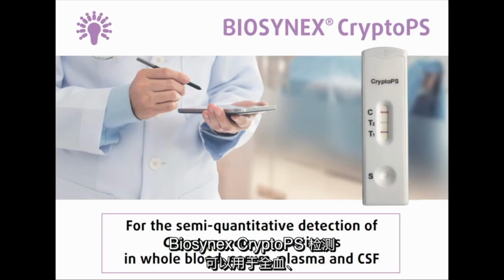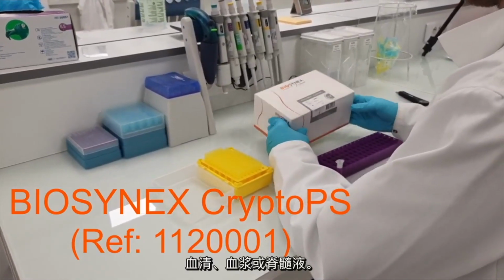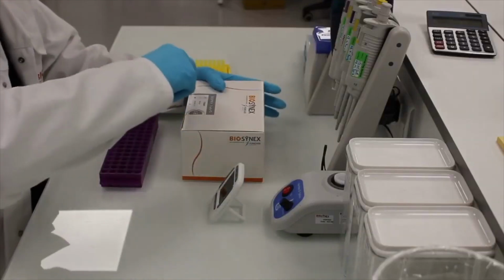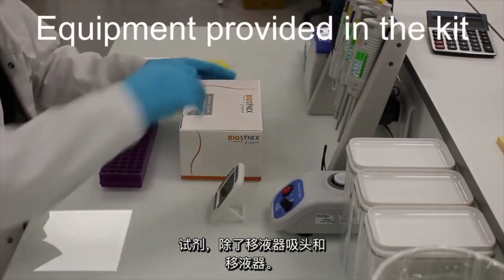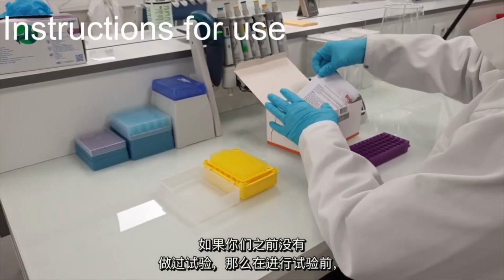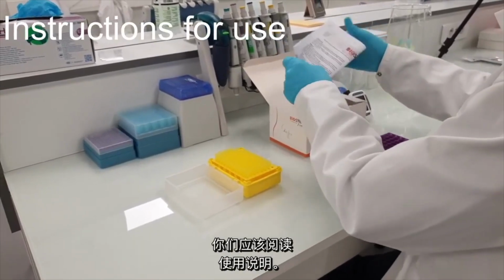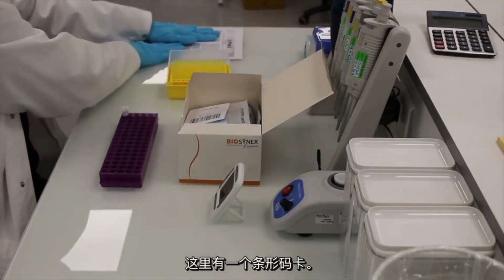Biosynex CryptoPS assay can be used on whole blood, serum, plasma or spinal fluid. When you open the box, you'll find inside all the reagents that you need apart from pipette tips and pipette. You should read the instructions for use before you do the assay if you haven't done it before. There's a barcode card present.